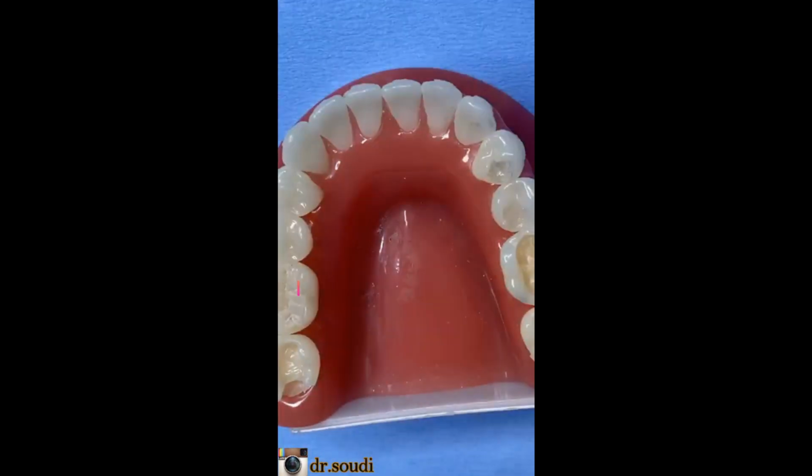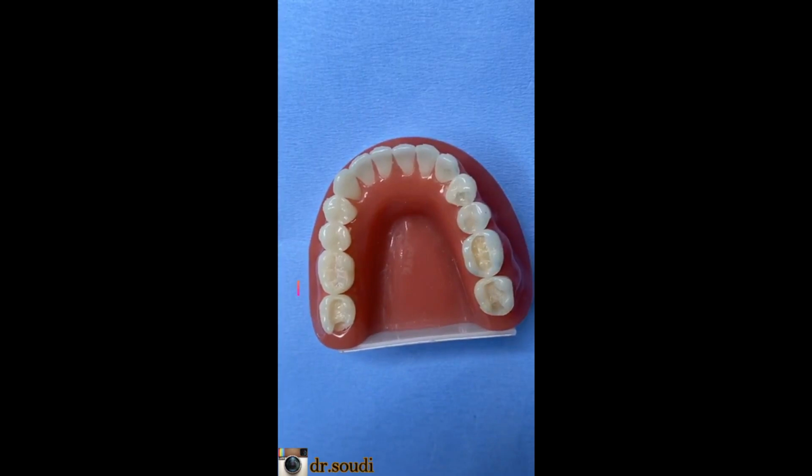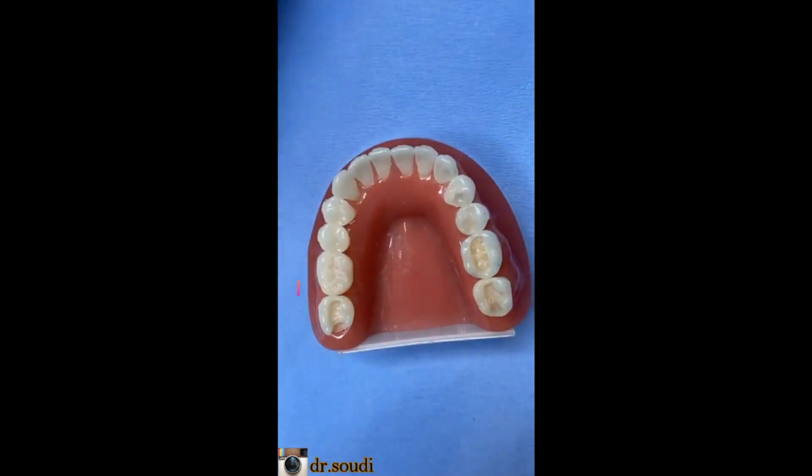Now we will make a quadrant isolation. Okay, and we will have only the floss ligature and we are done for today.